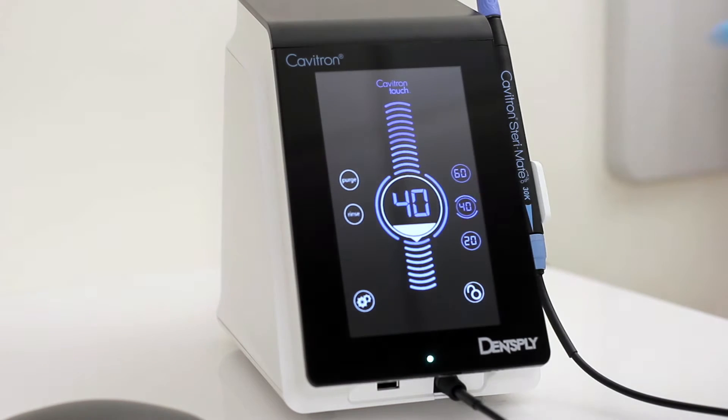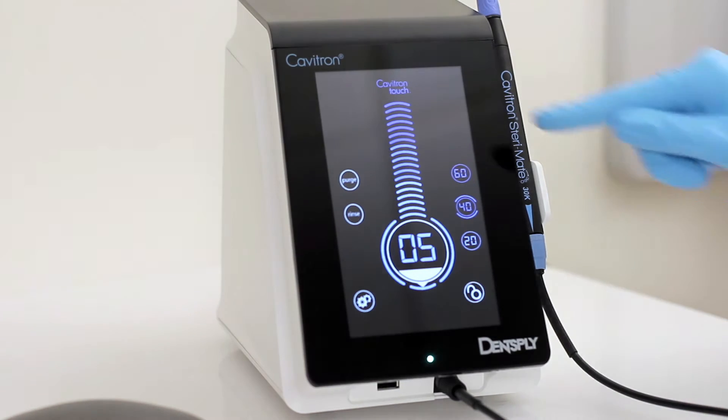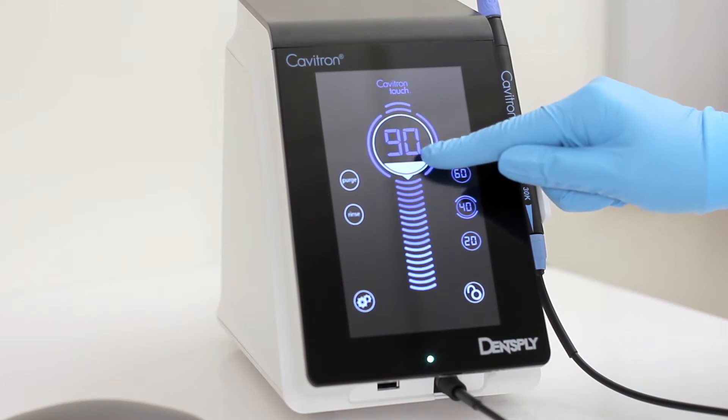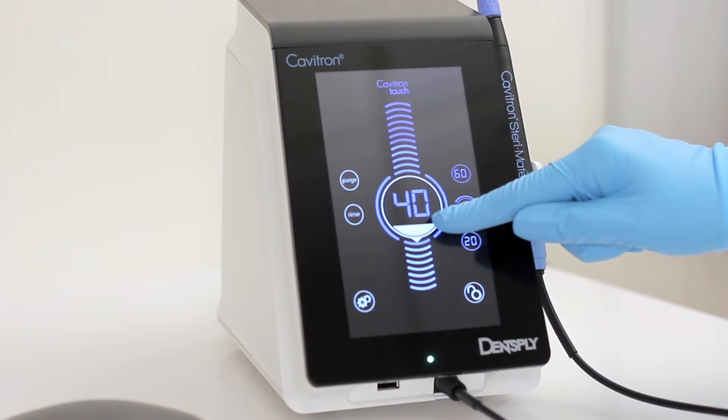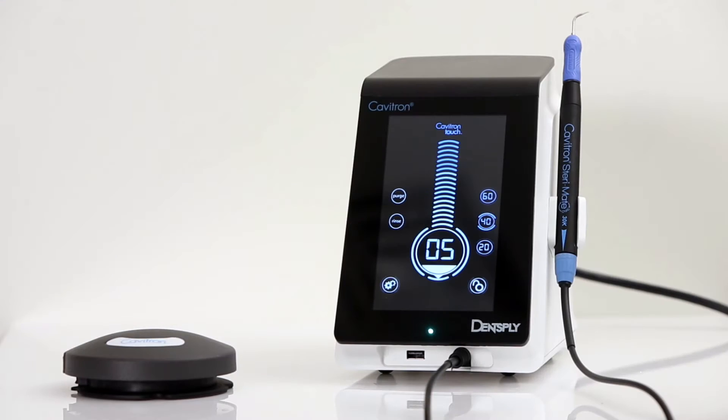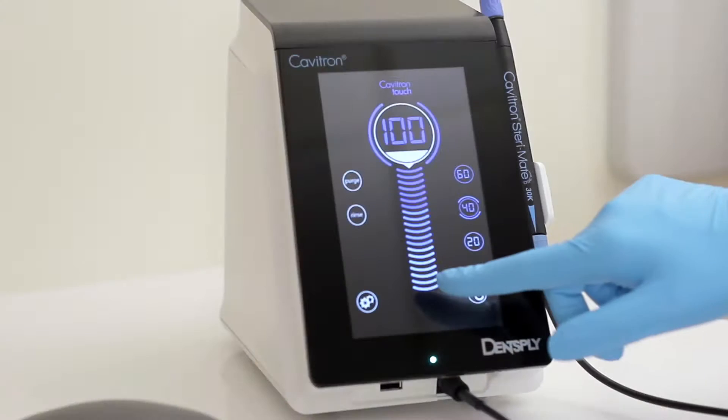The center of the screen contains the power level control. The number displayed in the bubble indicates the percentage of maximum power, ranging from 5 to 100 and increasing or decreasing in increments of 5 when held and slid up or down. The power level can also be selected by touching the scale either above or below the bubble.